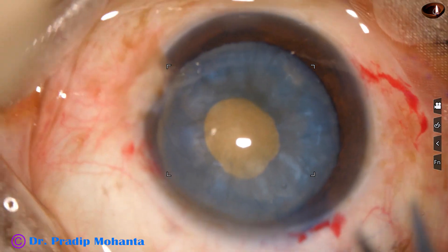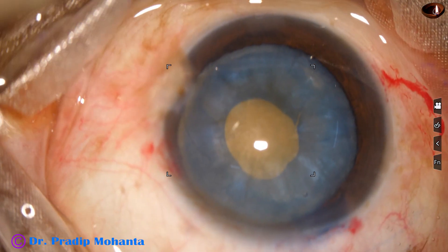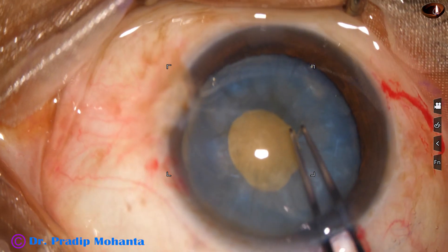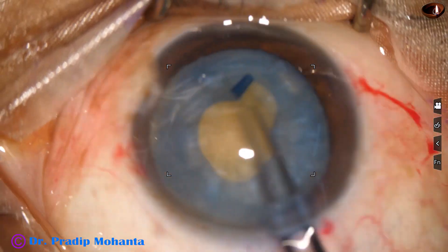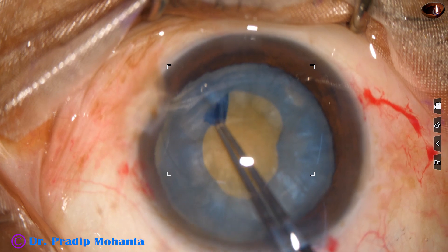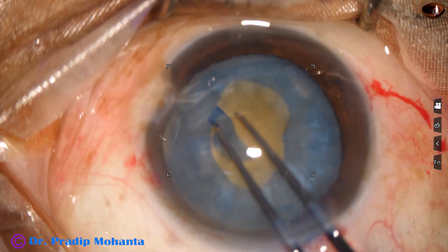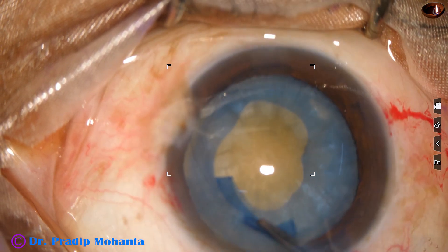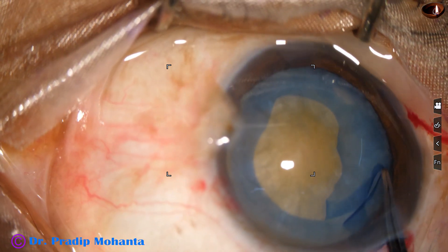I fill up the anterior chamber with viscoelastic, take a Keratome, and make a small nick at around 9 o'clock obliquely, then use the utrata forceps to go anti-clockwise. Here I have to go to the periphery, otherwise I cannot do the optimum size rhexis.